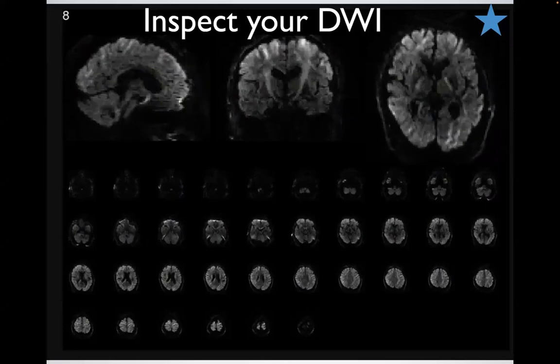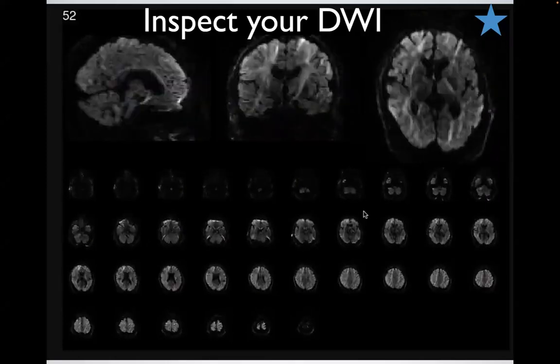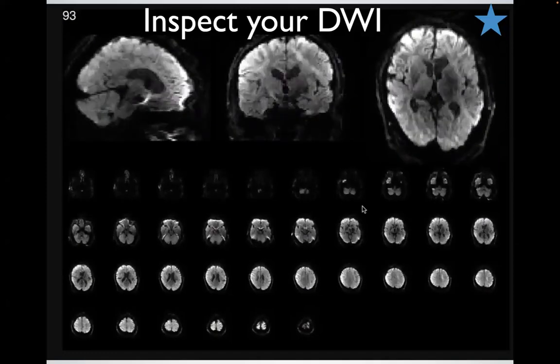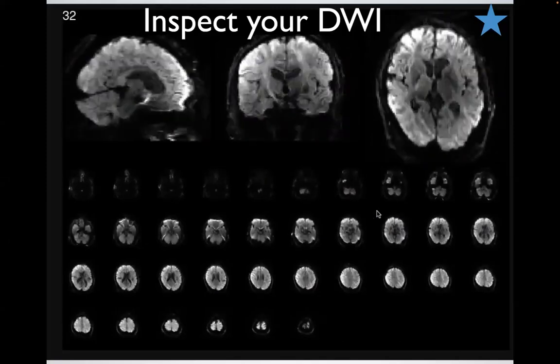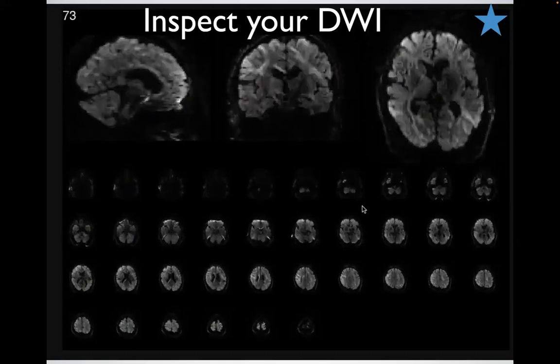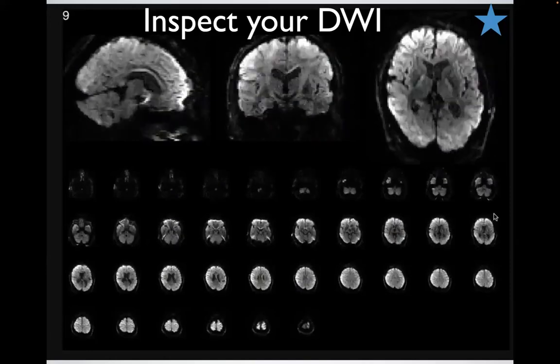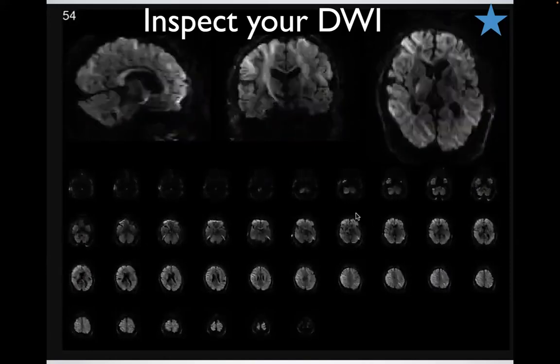And because we're going fast, we have susceptibility artifacts. We go from air to the sinuses to brain, and suddenly there's a collapse in the signal. There's a huge change in magnetic field locally, and we have these drops. So we need to correct for that. There's noise, there's motion, there's eddy currents at the boundaries. So lots of problems.